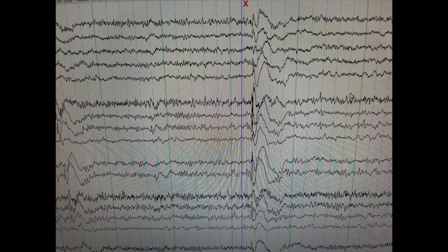I was really proud of my reading skills, so I went and told my co-workers and asked what they thought. I showed them the marks on the EEG — we looked at the first one and weren't sure, but then we looked at the others and agreed: it spreads to the other electrodes, the aftergoing slow wave is present after the very sharp spike, and they were in fact epileptic discharges. Big shout-out to my co-workers. If you're a newer EEG technologist, don't be afraid to ask experienced colleagues — mark suspicious things and talk it over. Collaboration ends up being the best result.